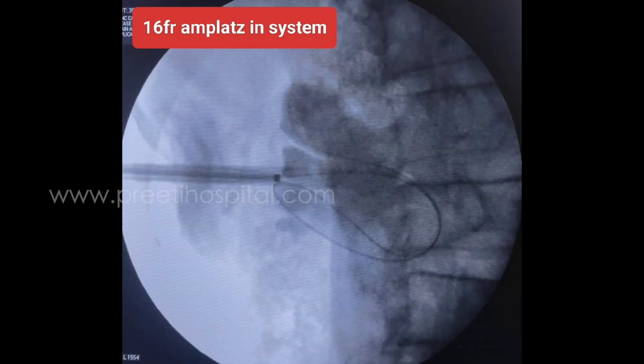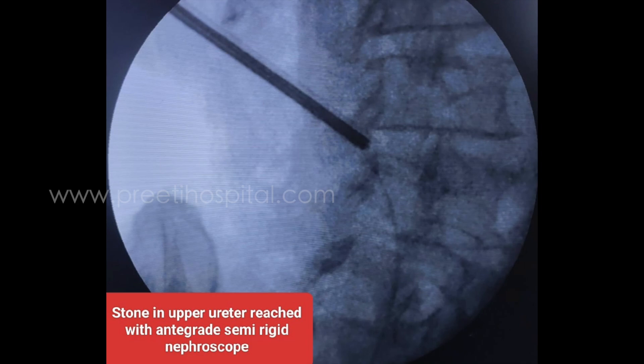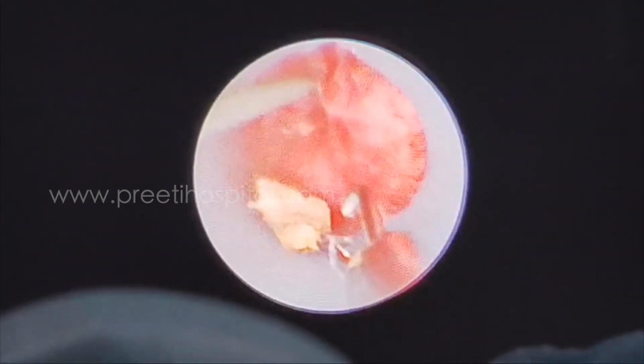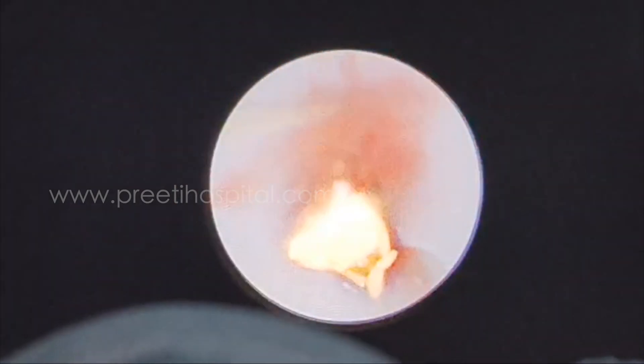This is the 16 French Amplatz sheath in the system. The upper ureteric stone could be reached with the anterograde semi-rigid nephroscope. Lithotripsy was done and fragments were cleared.